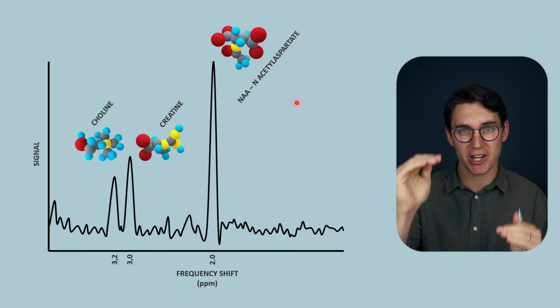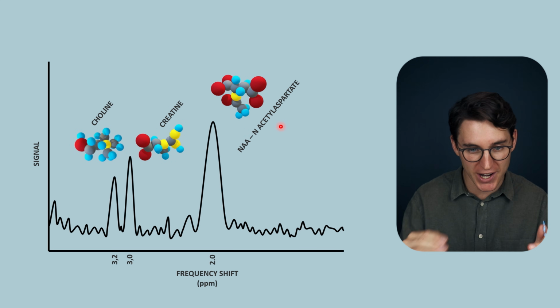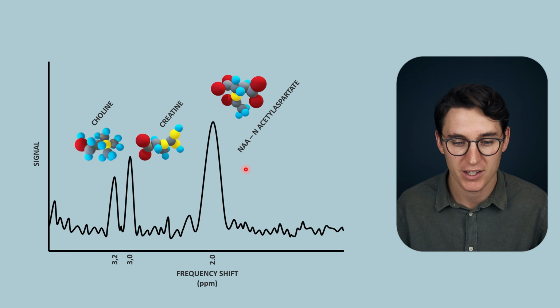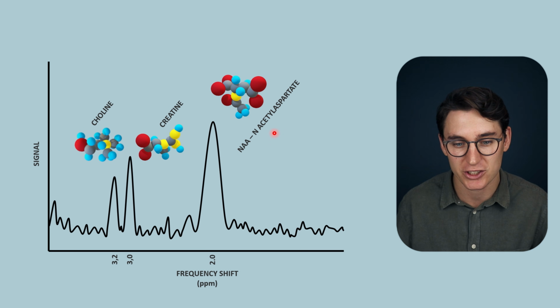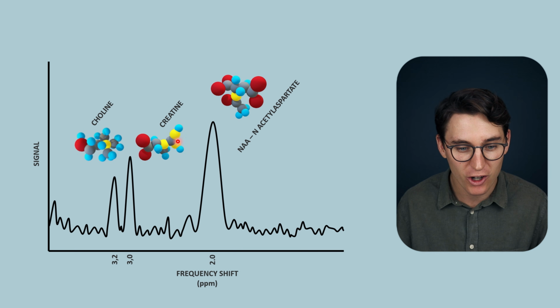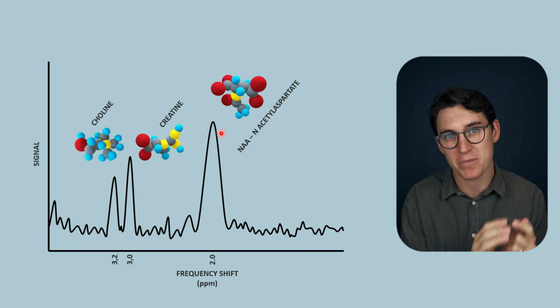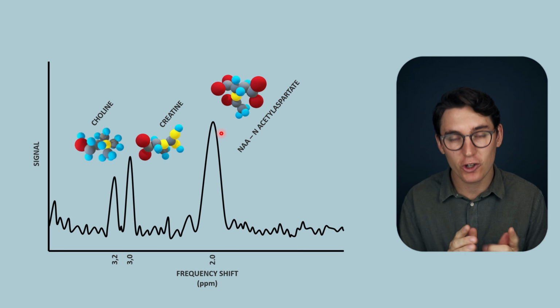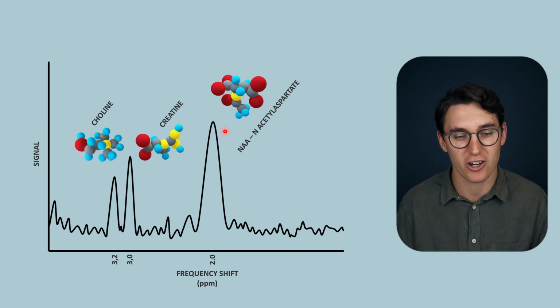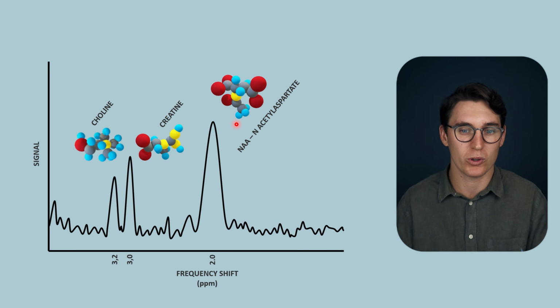Now, it's not only concentration that's going to affect the signal intensity of these different metabolites. We may get a change in our graph that looks like this, a reduction in the signal intensity from NAA. Now, that could be a reduction in the absolute concentration of N-acetyl aspartate, or it could be the type of pulse sequence that we use. These metabolites are going to relax at different rates. Any different tissue has a different relaxation rate, a different T2 star rate. If we use shorter or longer TEs or shorter or longer TRs, we're going to get changes in signal intensity, just as we got changes in signal intensity between water and fat.